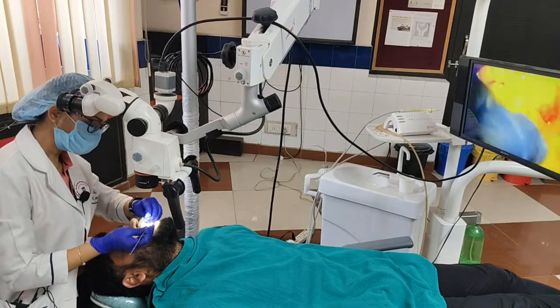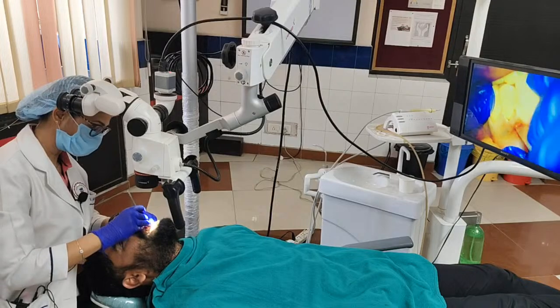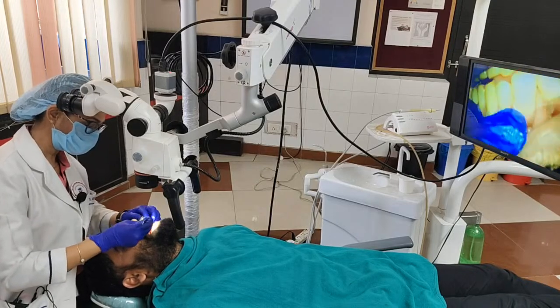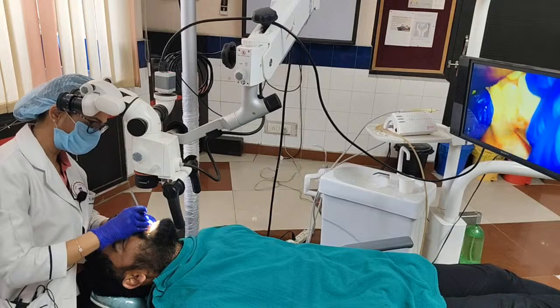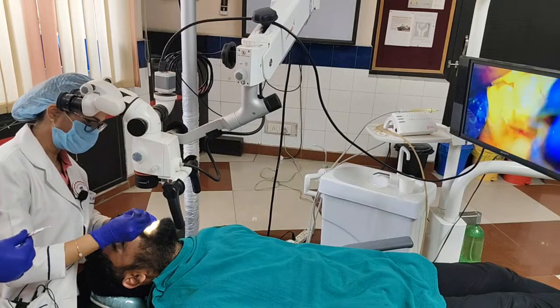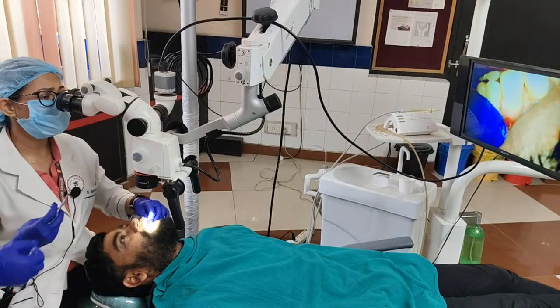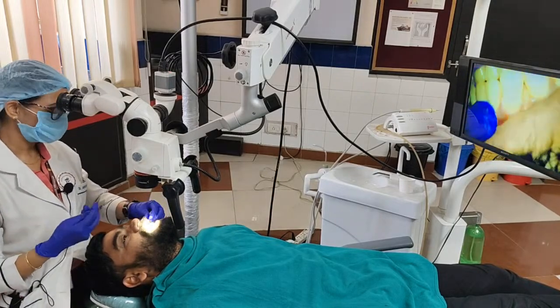So there are other methods also of depigmentation. This is just a scalpel method, but you will be surprised to know this is a very simple method which is still the gold standard. Always remember, gold standard means nothing can beat that. So the gold standard for depigmentation is still scalpel depigmentation.